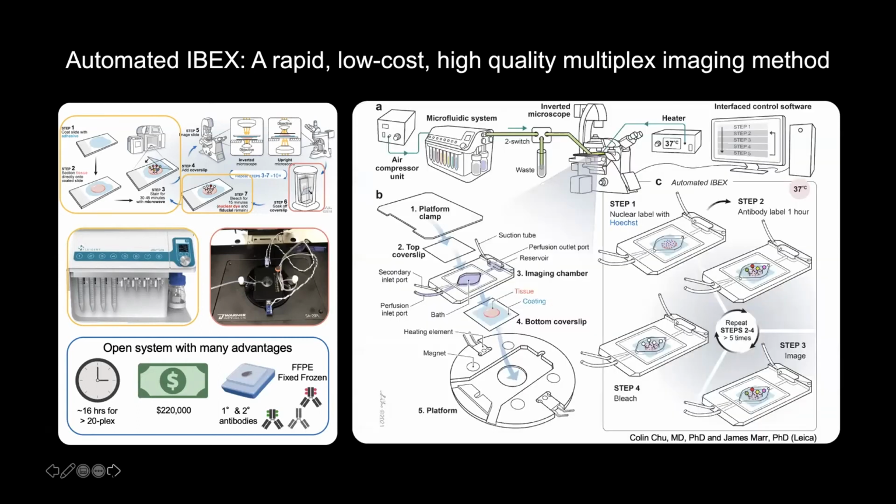And so I'll just show you, this is the overall workflow. Again, we're writing a very detailed protocol summarizing this because we want wide adoption. And so here we've taken this microfluidic device. The rainbow colored indicates a different panel or cycle number. It's pushed through into the imaging chip, and we put the tissue on a cover slip and create this closed chamber that accommodates 300 microliters of antibody.